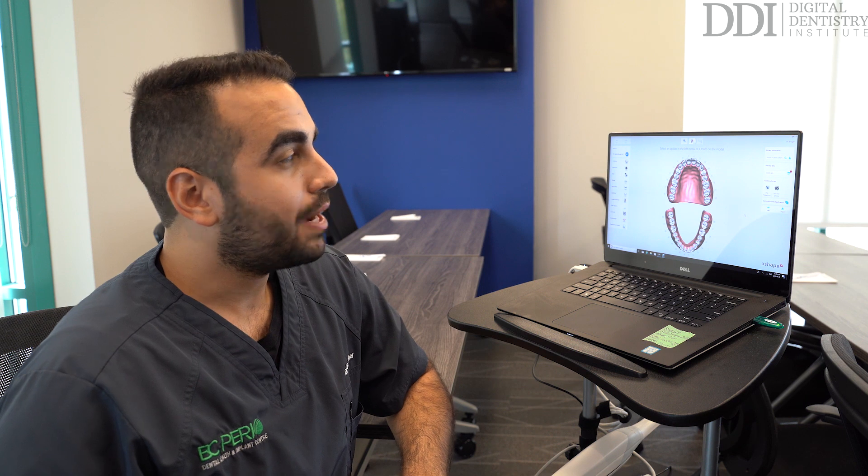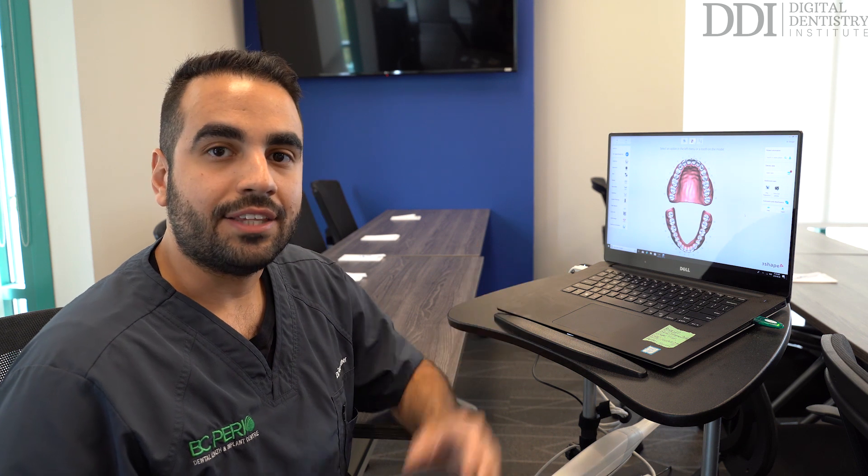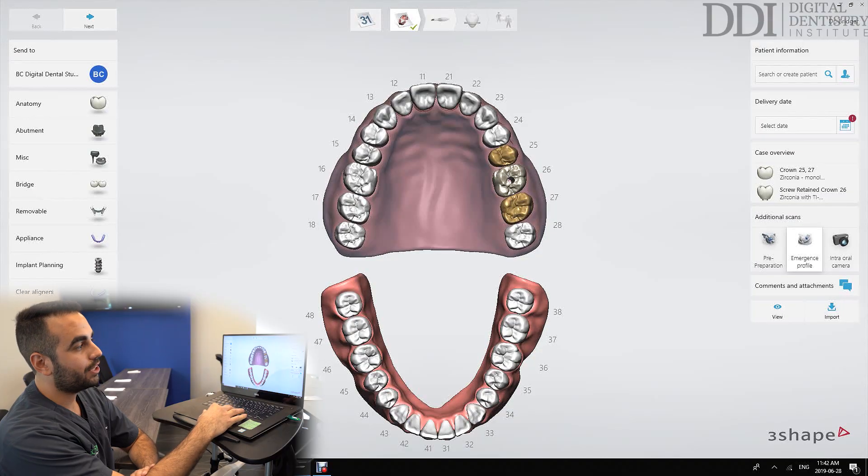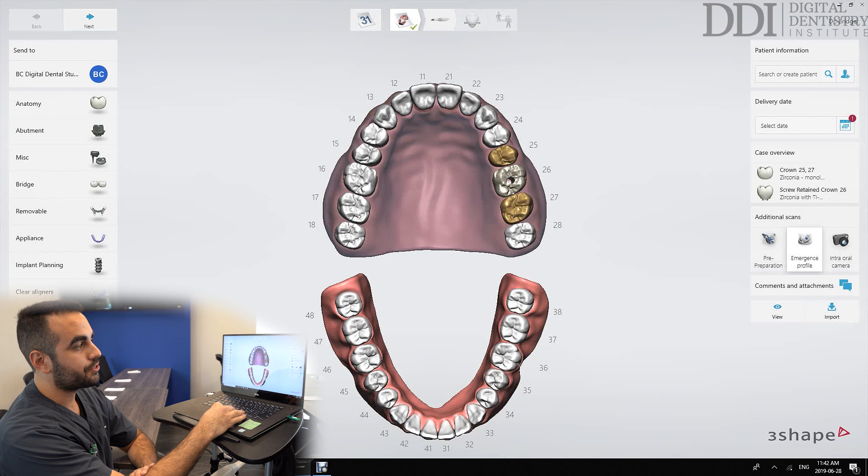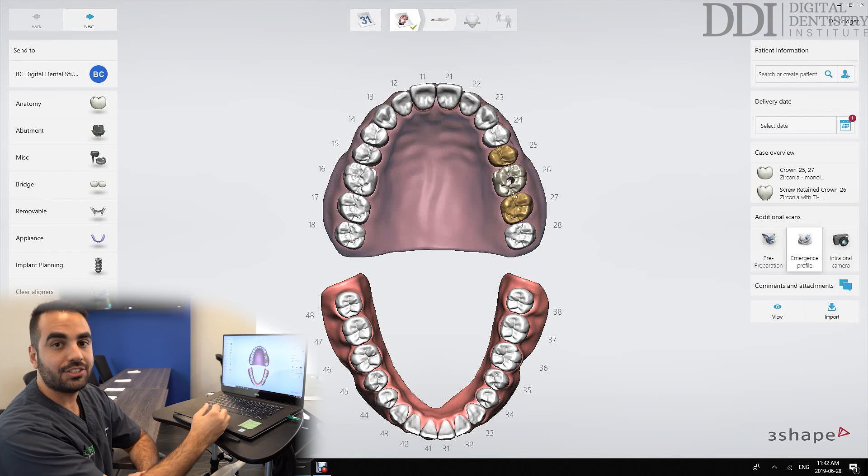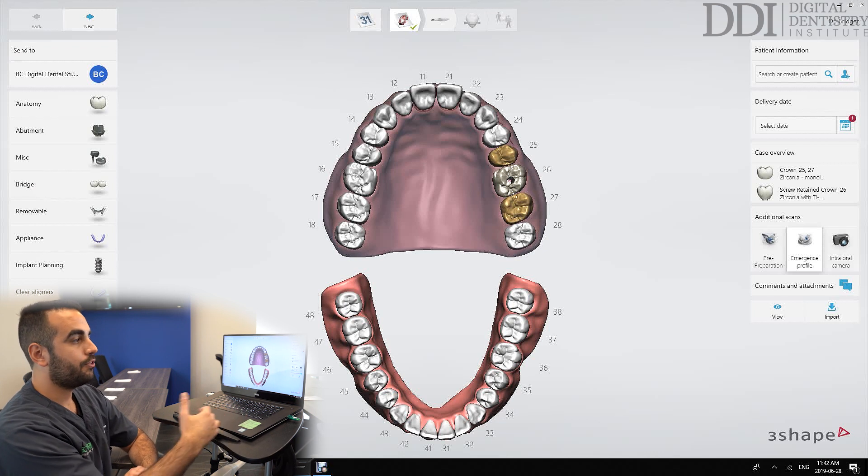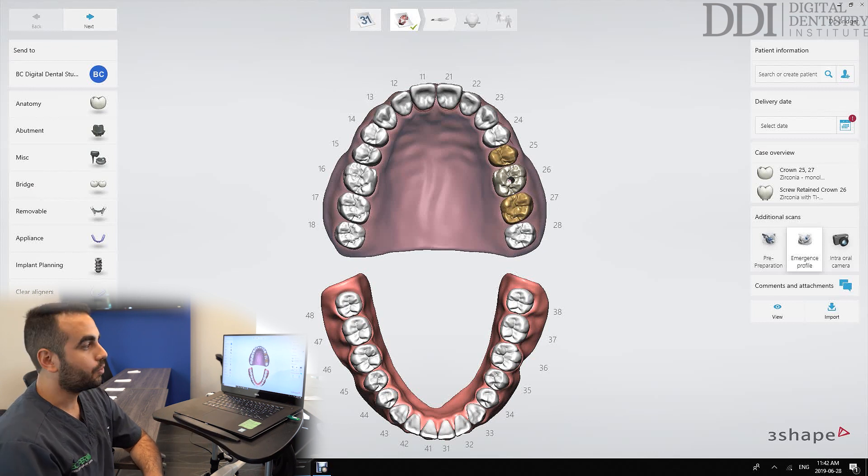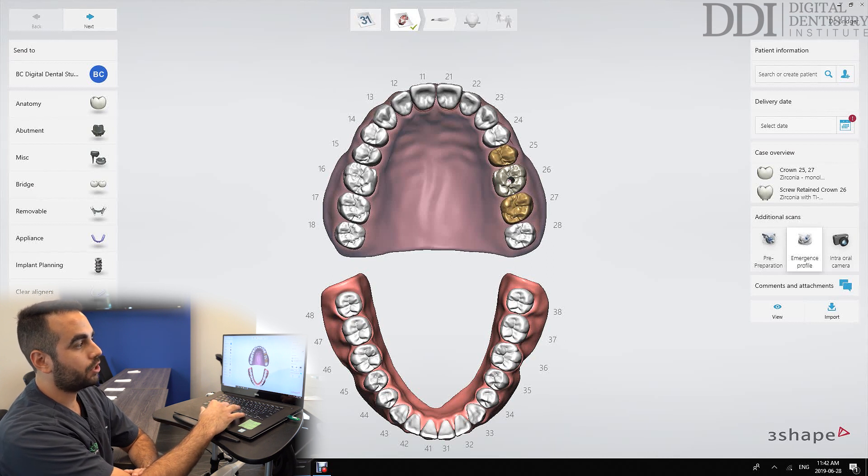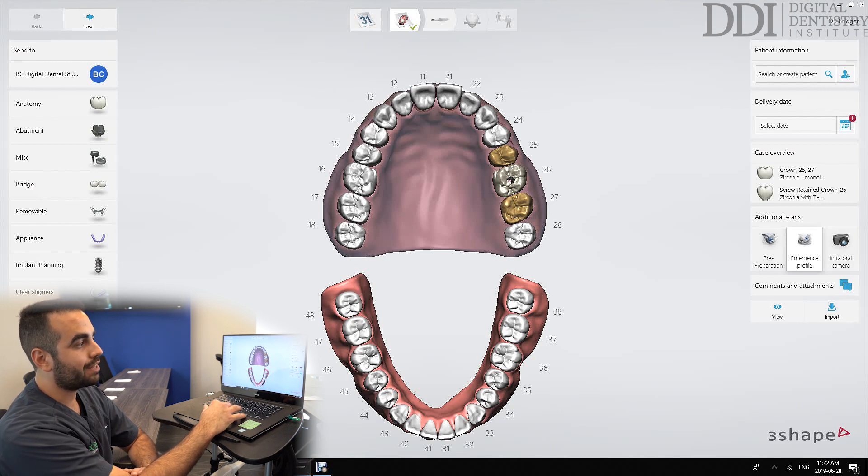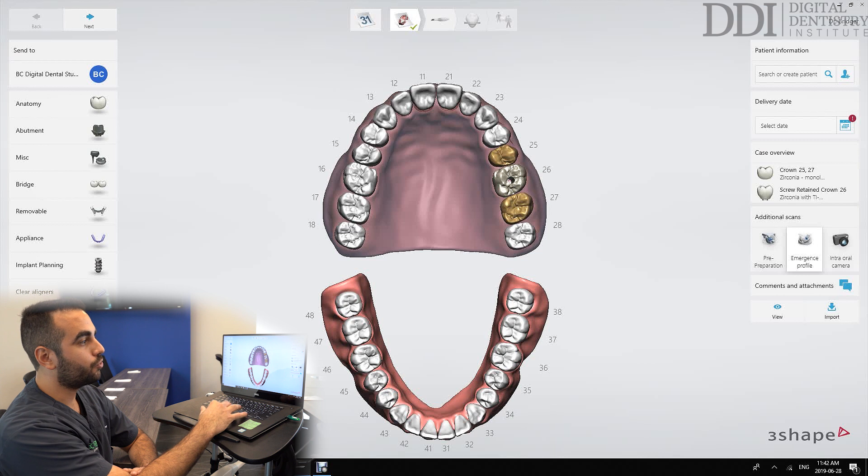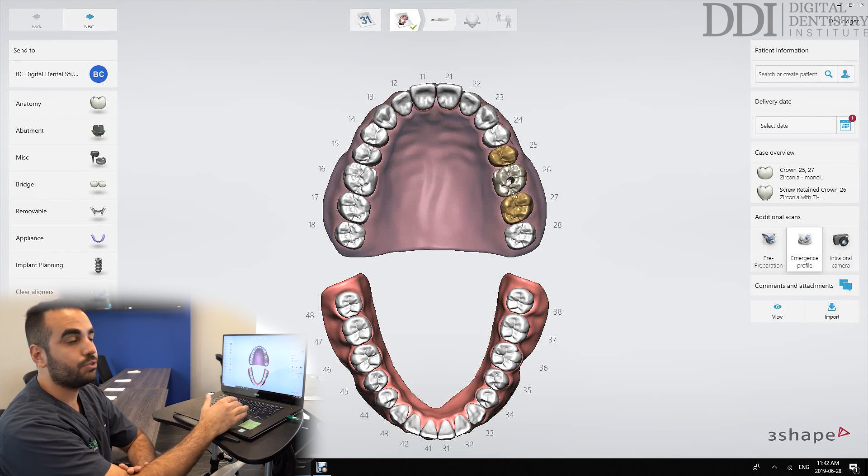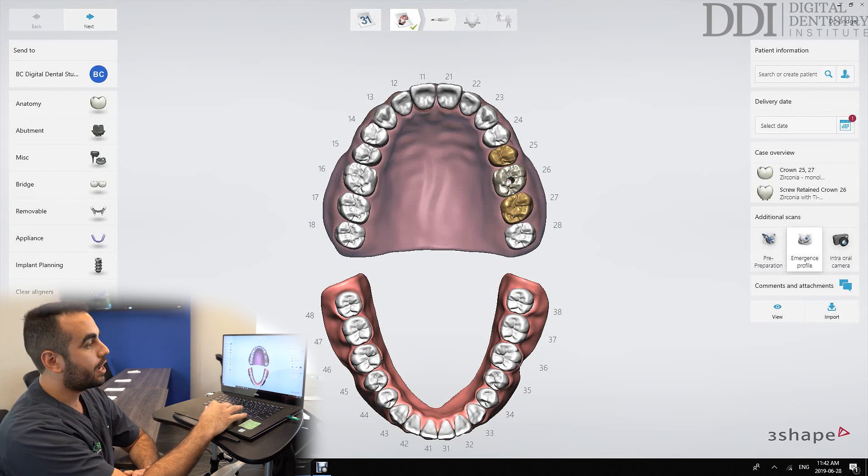So let's start by taking a look at the indication screen here on the TRIOS scanner. If we take a look at the right side of the screen we see the case overview and over there we can review the indications that we've selected. So two five and two seven and then we're creating a screw retained crown on implant in the two six region.